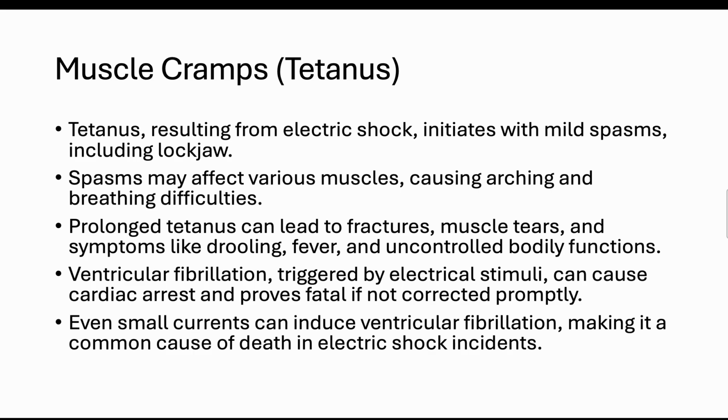So in this episode, I just wanted to go over the different types of physiological effect of electricity. These questions normally come up in interviews. If you apply for jobs here in the UK in the NHS, I've experienced it a couple of times when they discuss different effects of electricity. This is knowledge that's very important for engineers to know: the hazards associated with handling electrical equipment, and knowing the precautions that we need to take.